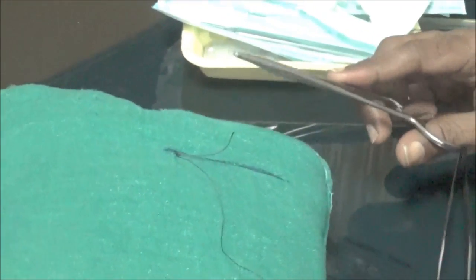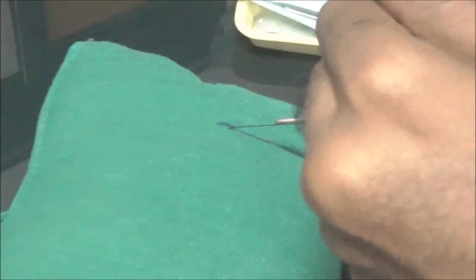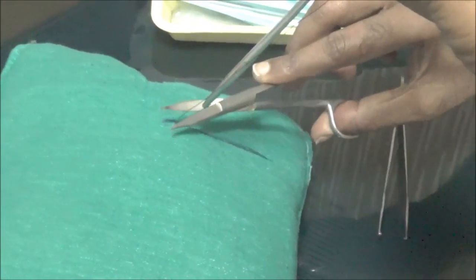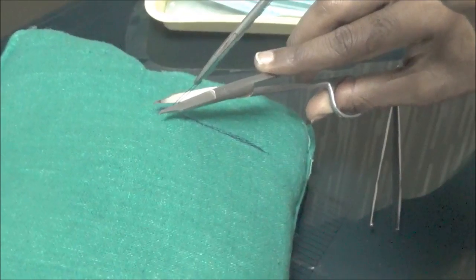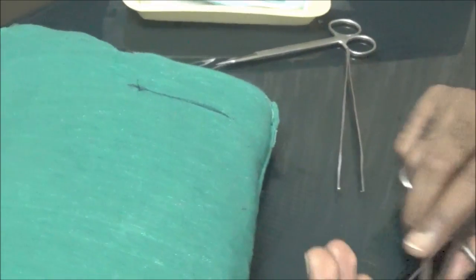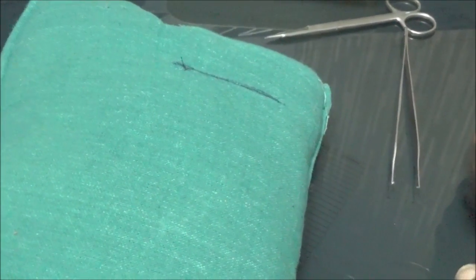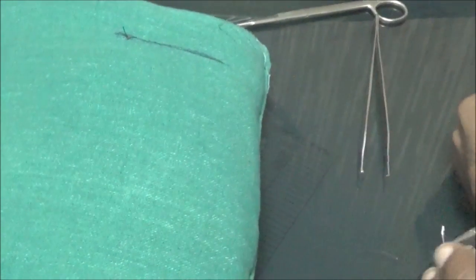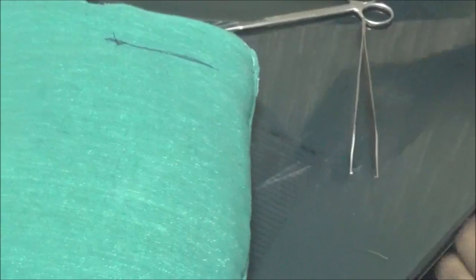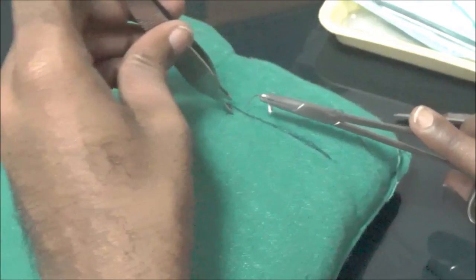To cut the suture: hold both ends in the same hand, leave 3mm, and cut — this is another rule of three. Don't cut too close or you'll have difficulty removing the suture later. Don't leave too much excess either, as it may irritate the soft tissue, tongue, throat, or cheek. Cut only what is necessary.